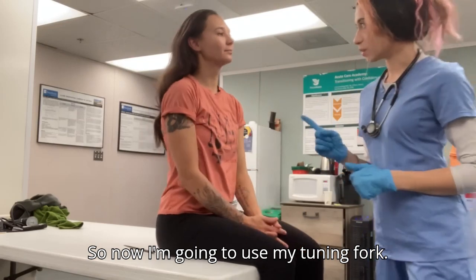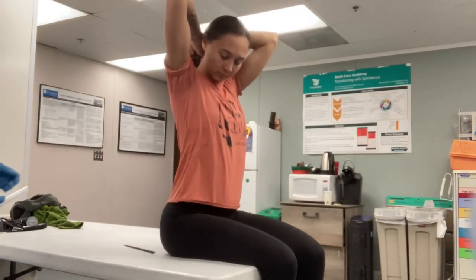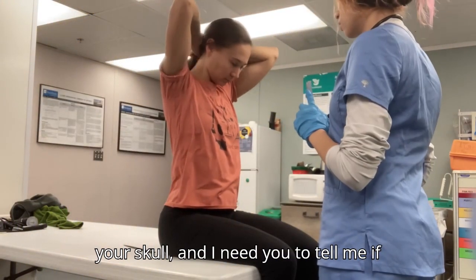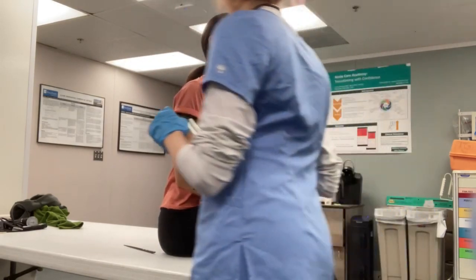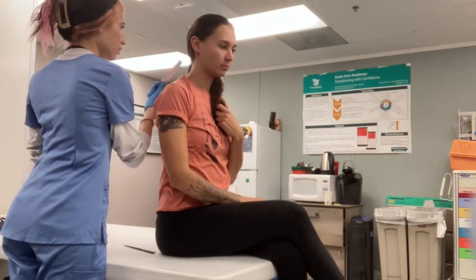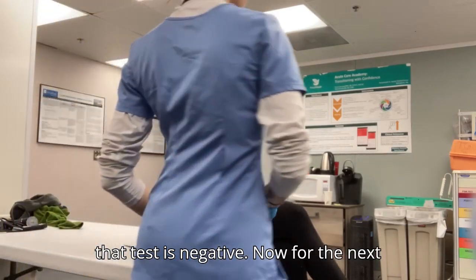So now I'm going to use my tuning fork. Let's see here. I'm going to place this at the base of your skull, and I need you to tell me if you hear it on one side better than the other. I hear it equally. Wonderful. So that test is negative.